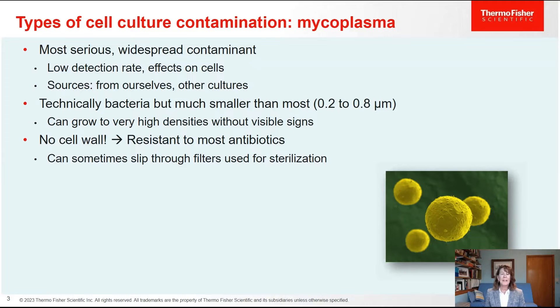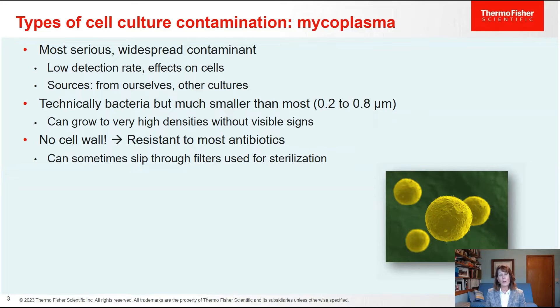The next type of contamination is mycoplasmas. These are the most serious and widespread contaminants in our cultures because they're not detected very well. It's very common that people are not aware that they have a mycoplasma contamination, and also because of their negative effects on cultured cells. Mycoplasmas come from us, from other cultures — there are more than 100 different species. It's very common to get a mycoplasma contamination from cross-contaminating from another culture, or from a culture received from a collaborator.